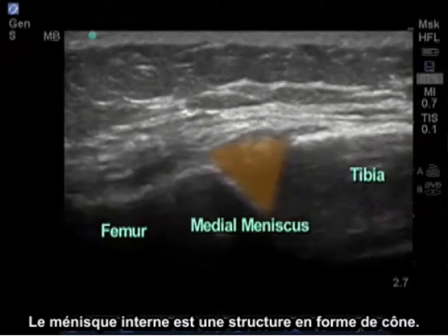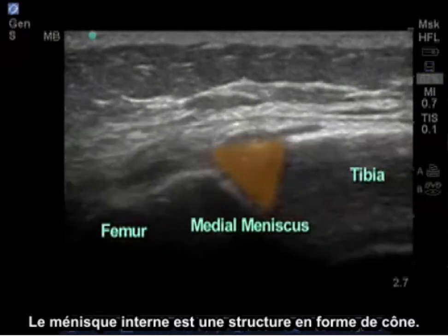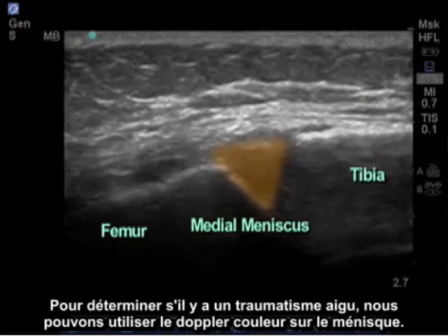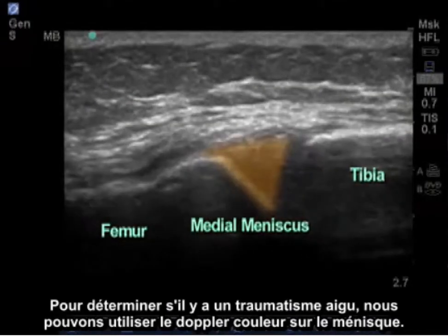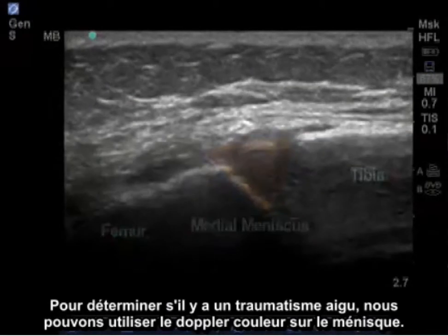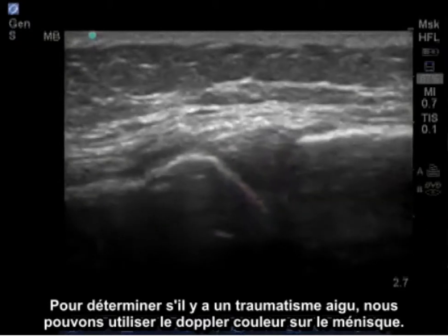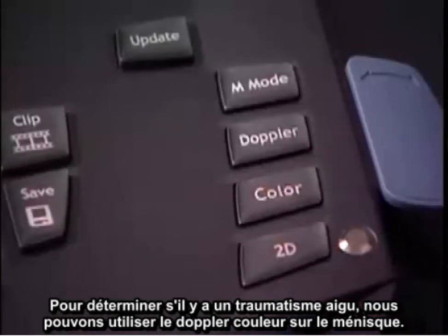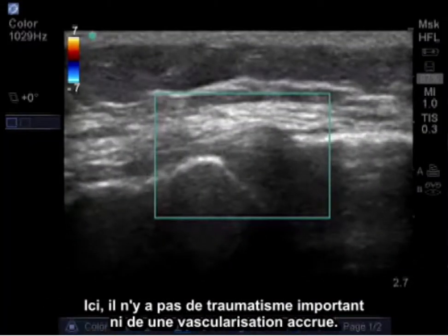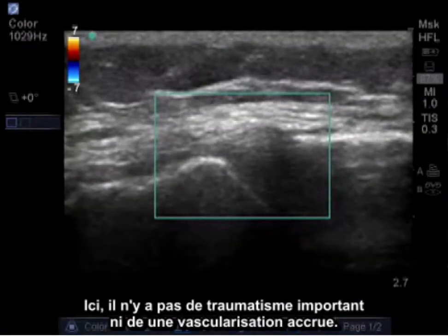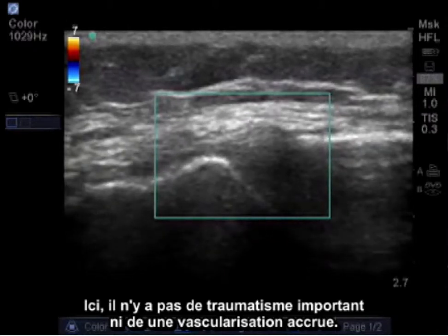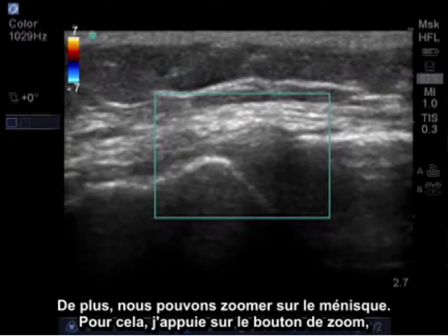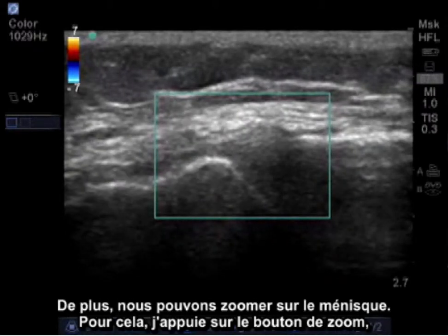The medial meniscus is a wedge-like structure. To determine if there's acute trauma, we can put color Doppler on the meniscus. Here, there's no significant trauma or suggestion of any increased vascularity.